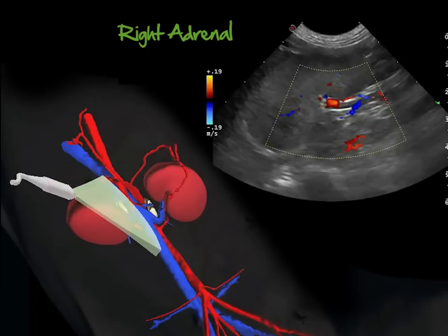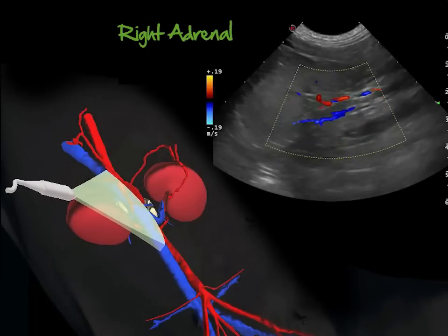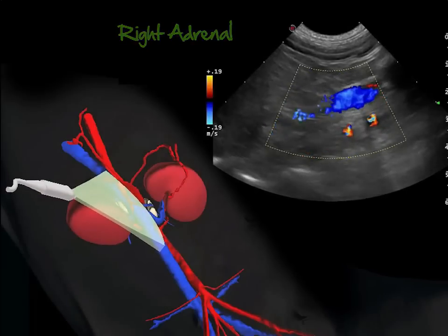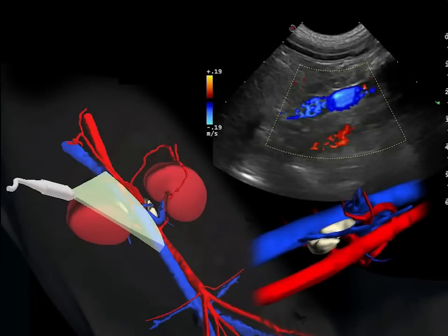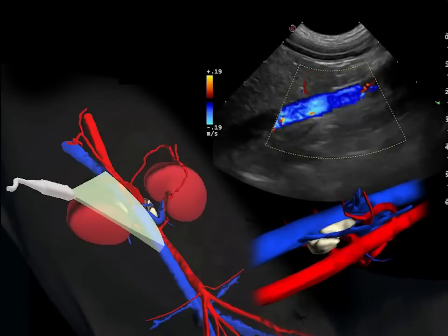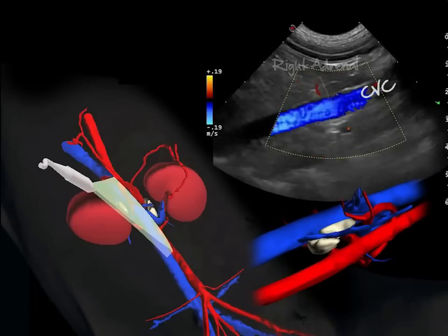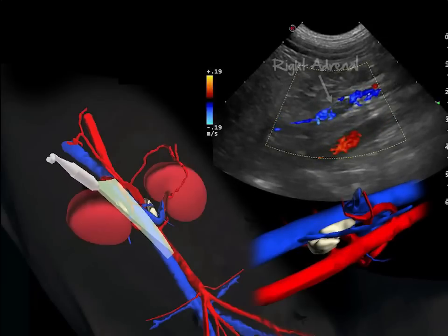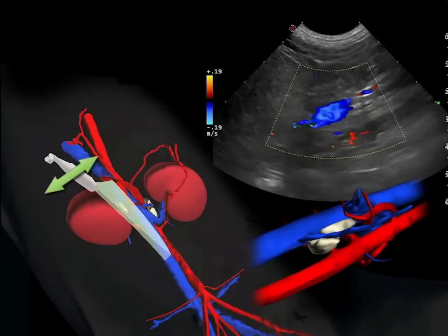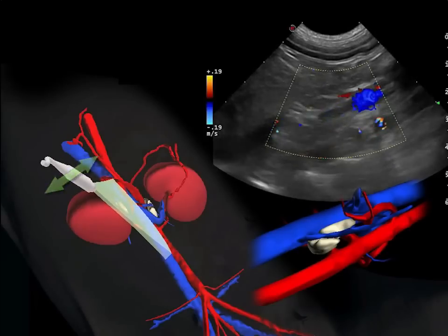In the longitudinal plane, starting from the right kidney, move the probe cranially behind the costal arch, turning it gently into an oblique plane to locate the caudal vena cava and aorta. Using the same plane, turn the probe laterally to identify the adrenal just lateral to the caudal vena cava. The pressure applied by the probe may sometimes give the impression of a gland penetrating the lumen of the vena cava. You may sometimes need to move slightly laterally or medially to locate the gland.